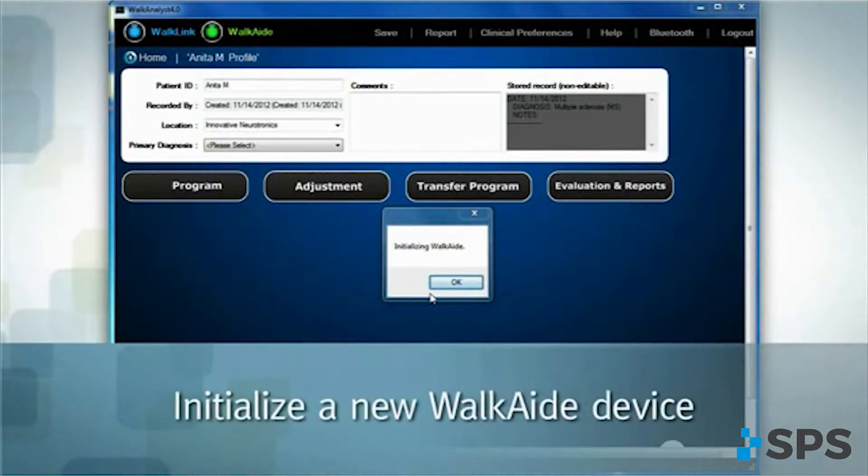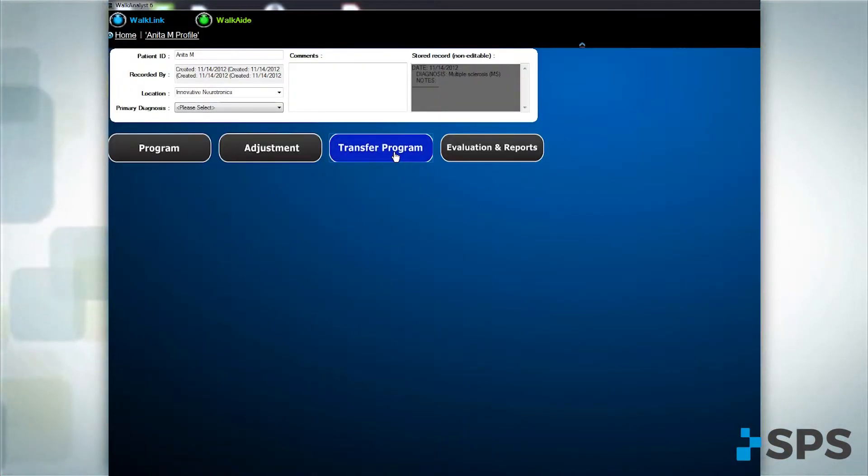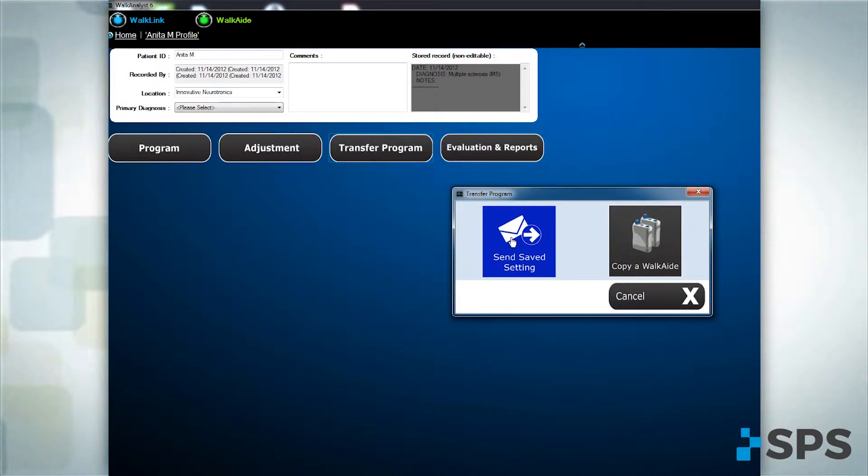Prepare the software and connect the patient's new WalkAid to the WalkLink. Click OK to initialize. Open the patient's profile and select the Transfer Program option. Click on Send/Save Settings.